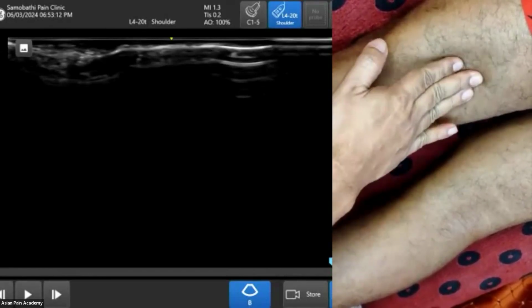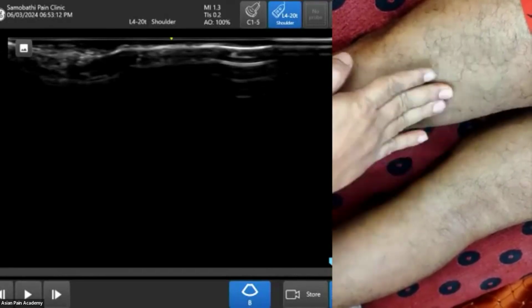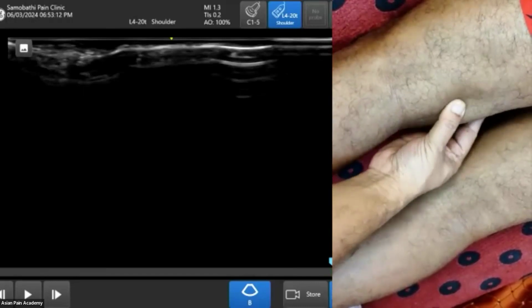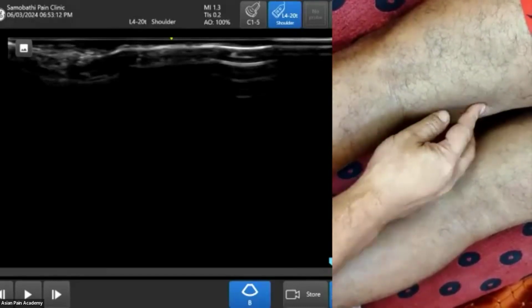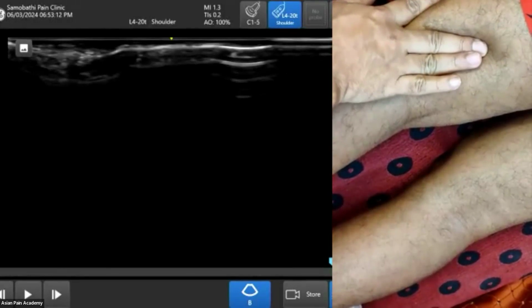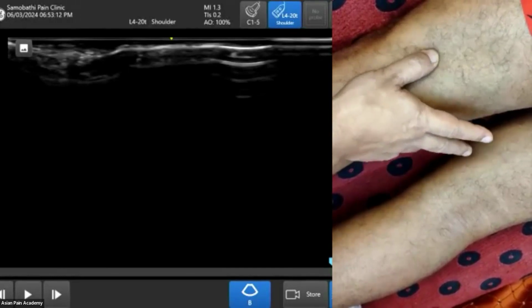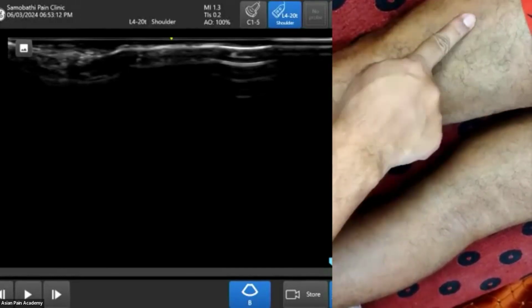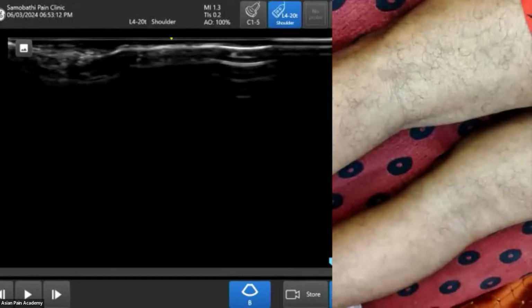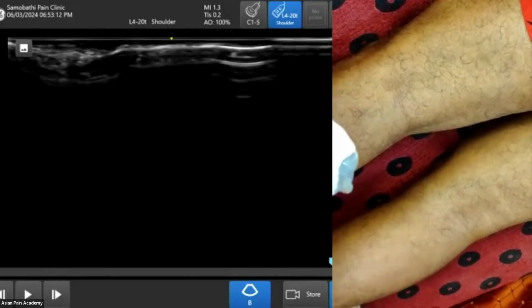You will be able to understand in your own body that here it is a muscle, here it is a muscle, and in between there is a loose area. The muscle on the medial side is the semitendinosus and semimembranosus, and the lateral side is the biceps femoris. The peroneal nerve must come at the margin of the biceps femoris. So first we will locate the peroneal nerve and then we will search for other nerves, so it becomes much easier.